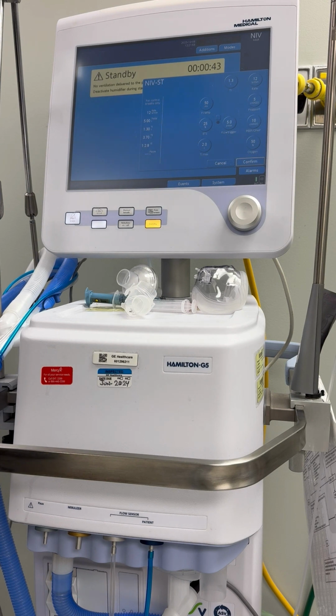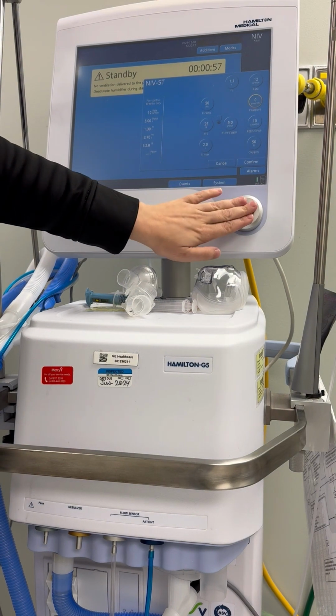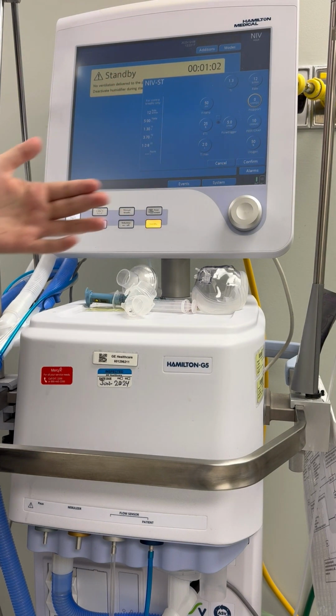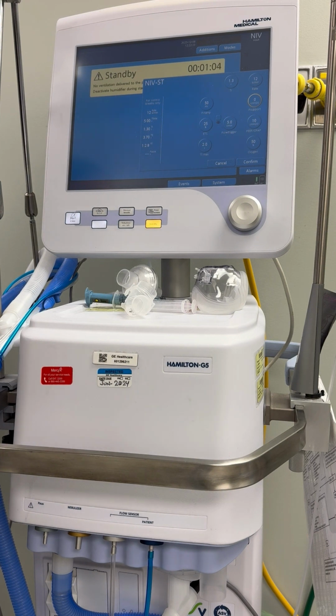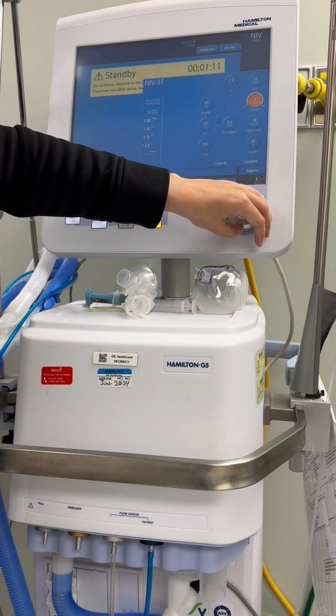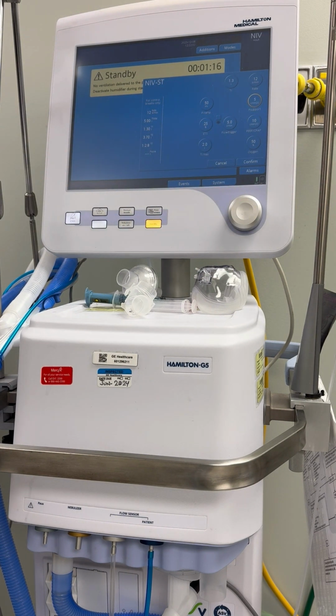So if I want to place a patient on just CPAP, then I would not need that pressure support delivered at all. If I just want to give my patient CPAP, I would turn my pressure support down to 0, so that way the patient is only receiving 10 of CPAP. If the patient begins to exhibit signs of difficulty taking in volumes or a little bit of respiratory distress, then we can go ahead and increase that pressure support as needed for that patient to be able to get those volumes in. So now I've added 5 of pressure support.